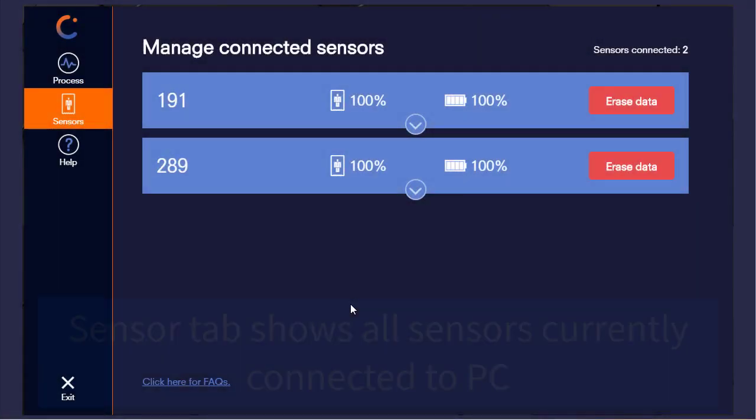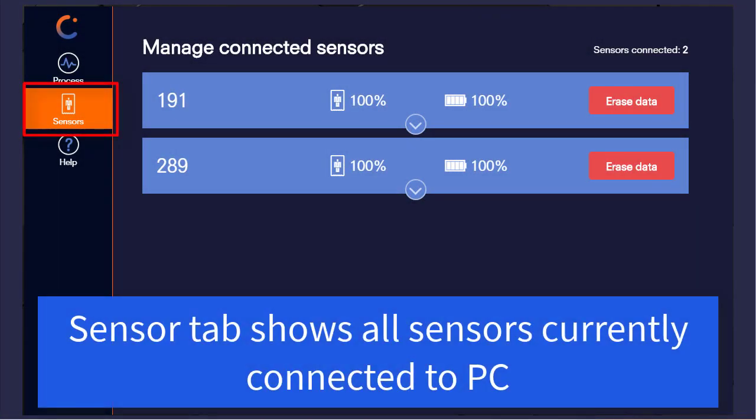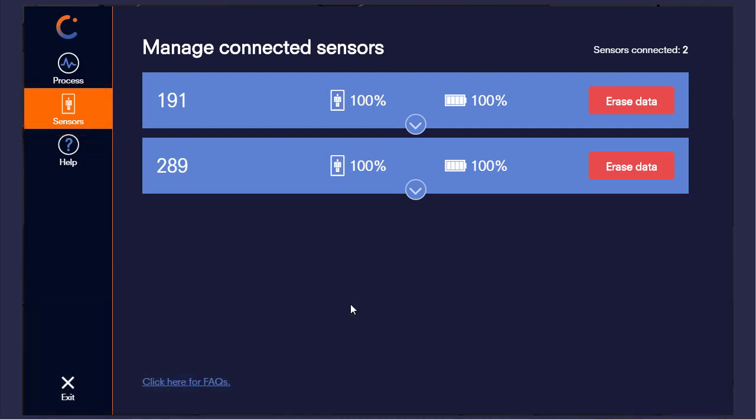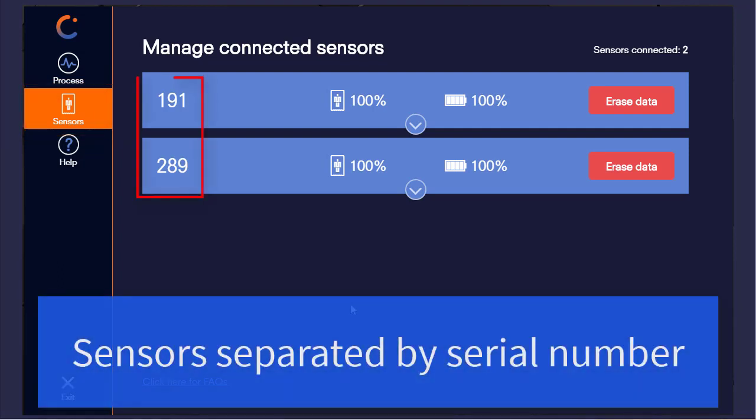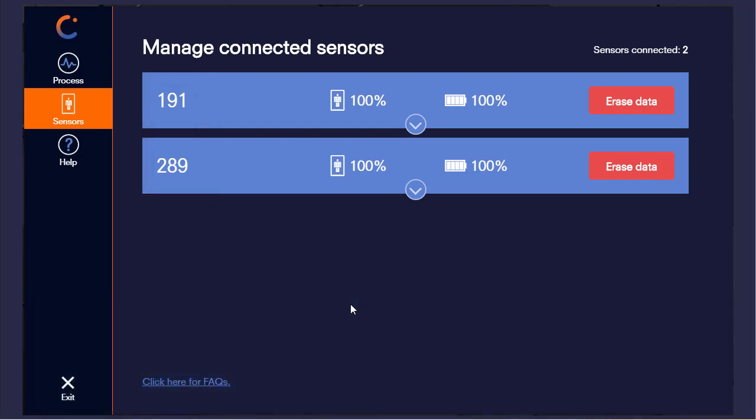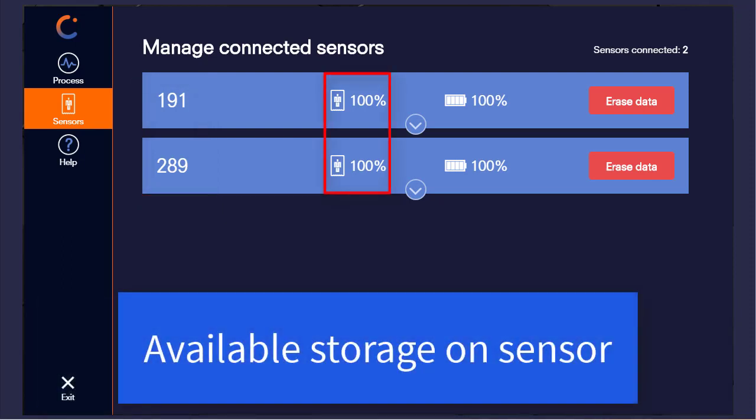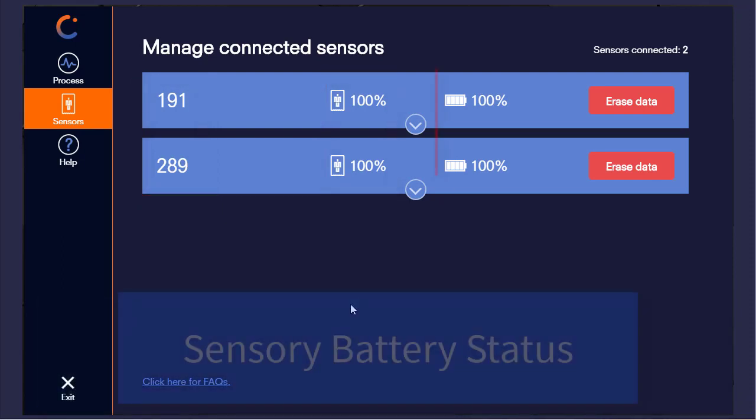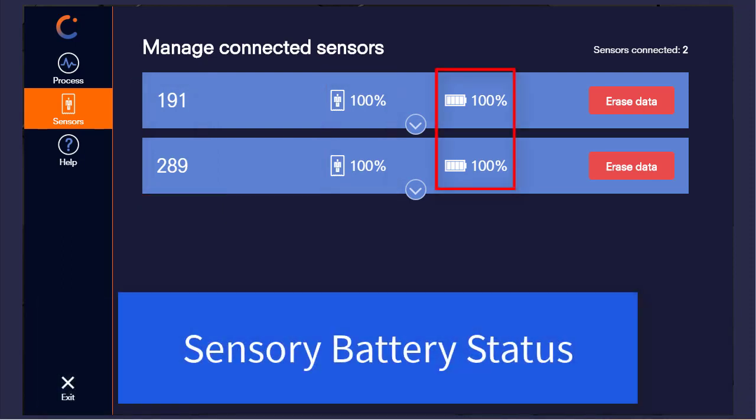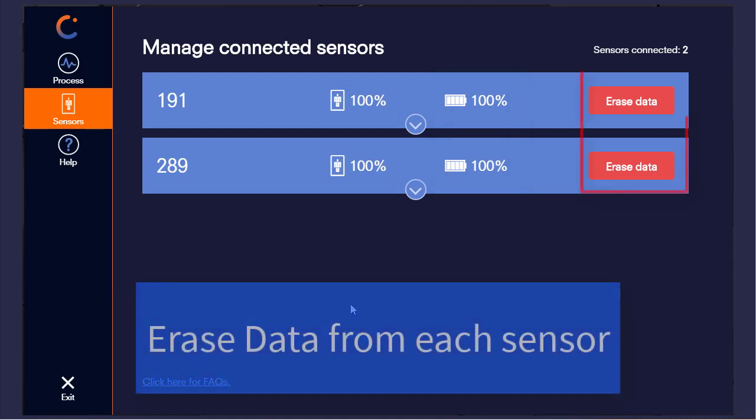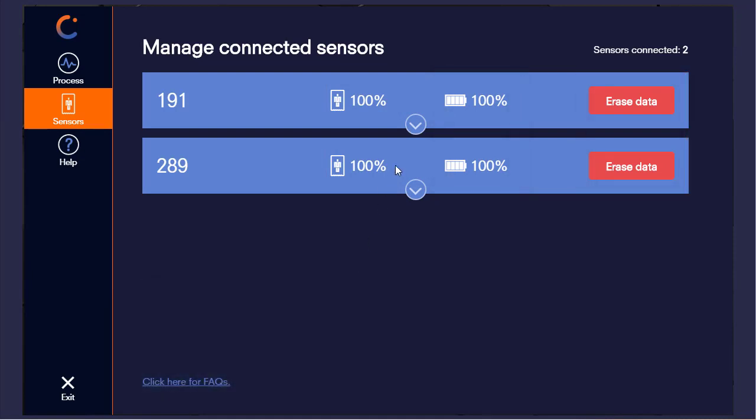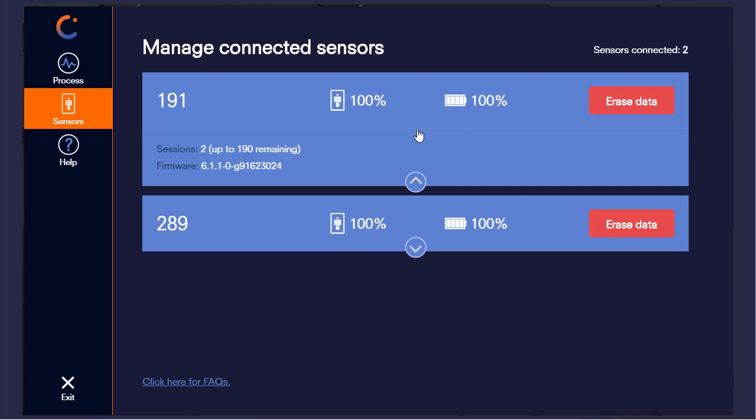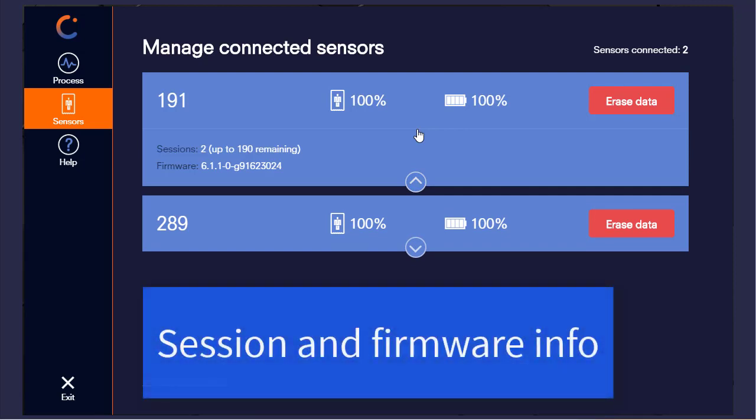As shown earlier, the sensor tab displays all the sensors that are currently connected to the PC. They are separated by serial number and then display information about the amount of available storage, the remaining battery life, and provide the ability to erase all data from the sensor.